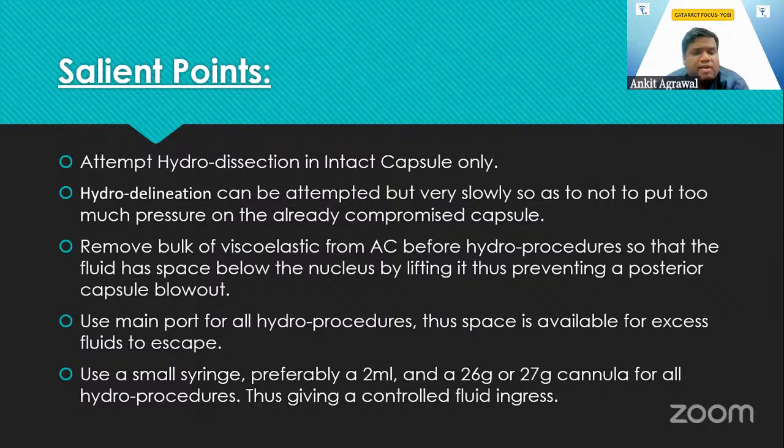We should use a small syringe, preferably a 2 ml, and a 26 gauge or 27 gauge hydrodissection cannula for all hydroprocedures, thus giving controlled fluid ingress. Thank you.